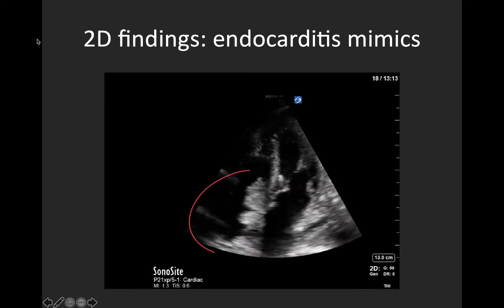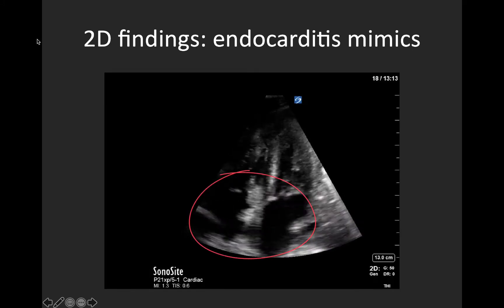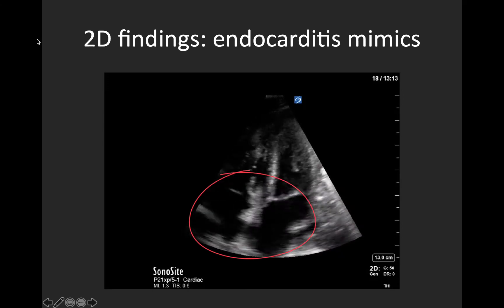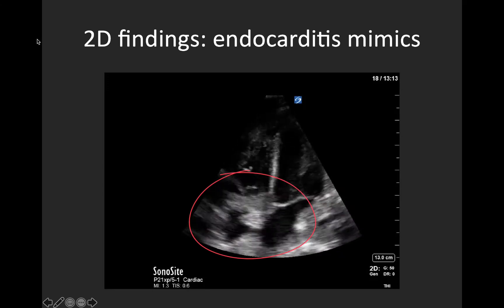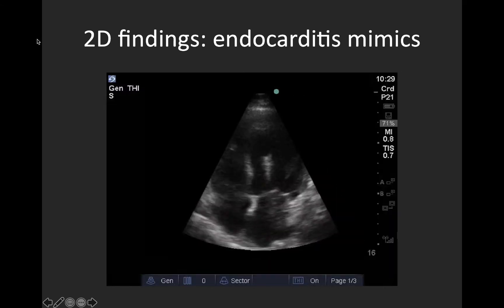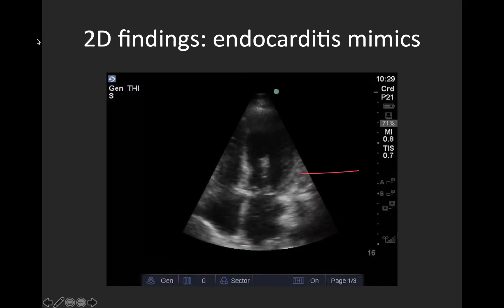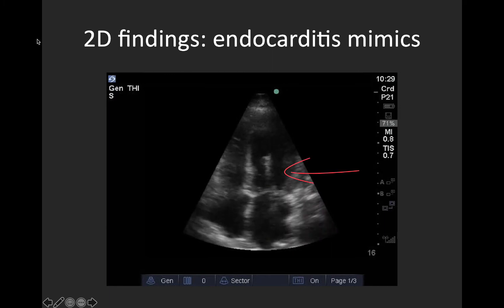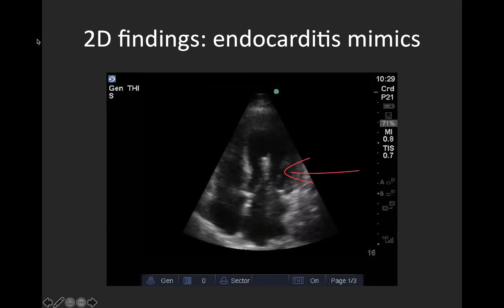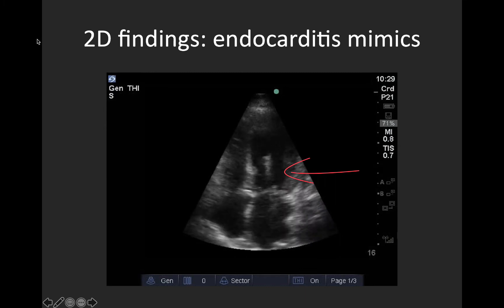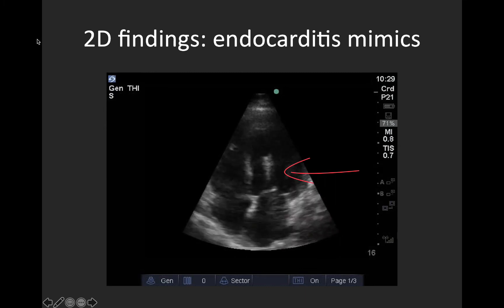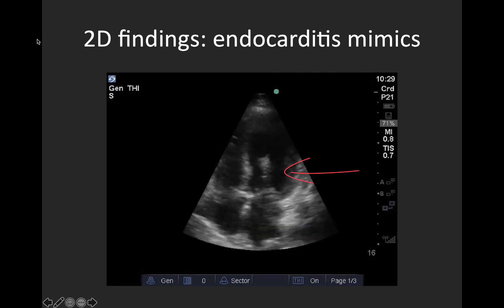This is another endocarditis mimic. Note that the hyperdensity seems to be attached to the interatrial septum rather than the valve — this was an intracardiac tumor, a lipoma. And one last mimic: here you can see an echogenic linear structure in the left atrium and ventricle, however it doesn't appear to move with the rest of the cardiac structures and wasn't visible in any other view. So this is an example of artifact.